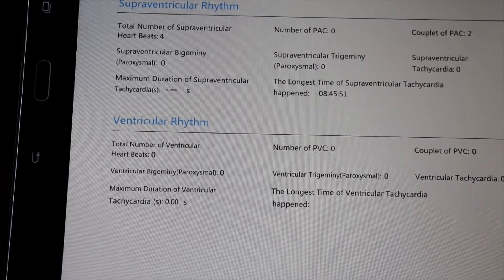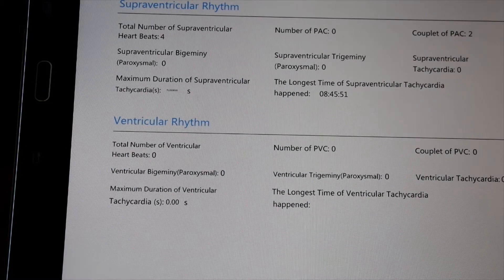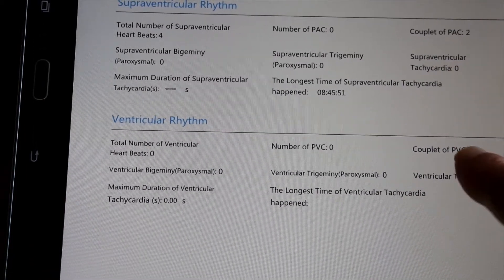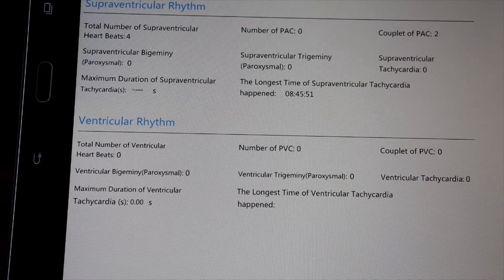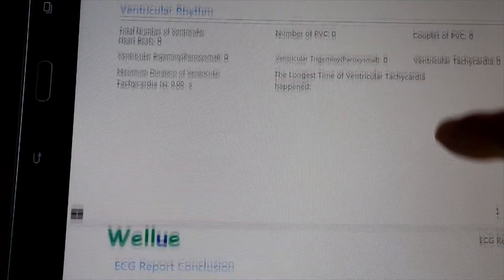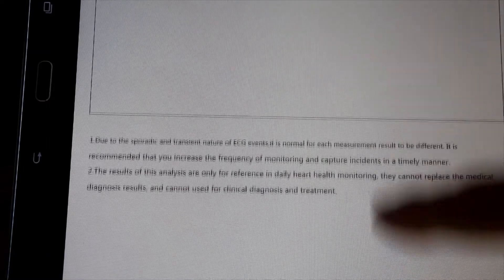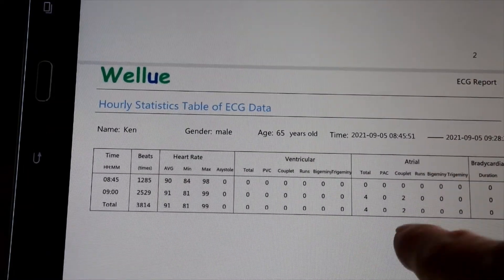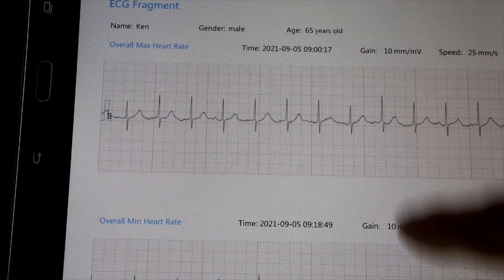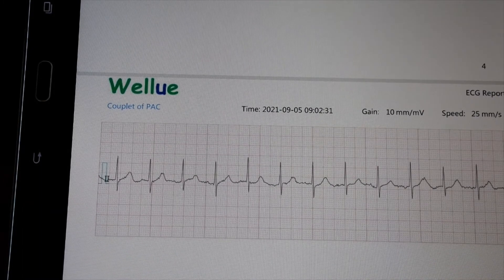We did actually find a little something going on with my walk. Right there, it found two PAC couplets, which is very minimal. The conclusion shows I'm in sinus rhythm with two couplets, and it shows you where they happened — including my heart rate, max heart rate, min heart rate, and where the couplets occurred.